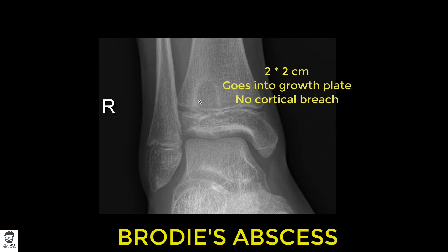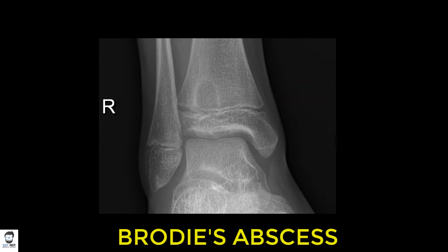You can see it's a well-defined lytic lesion, roughly two centimeters by two centimeters, extending into the growth plate. There's no cortical involvement, and the soft tissue shadows look normal. The ankle joint itself looks normal. This suggests it's a benign rather than malignant lesion — it doesn't look very aggressive.